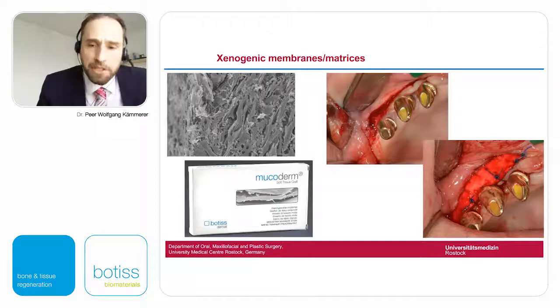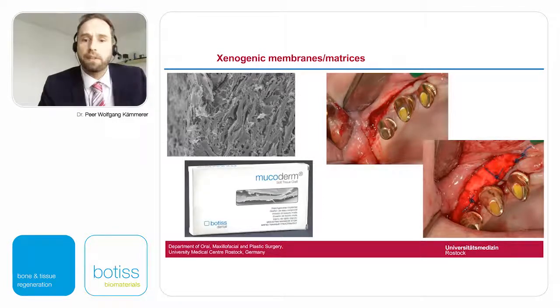Well, one of the major challenges after the vestibuloplasty, of course, is to reduce the post-operative discomfort, like scar contracture and subsequent, perhaps even loss in the sulcular depth. And as I told you, skin grafts have been most commonly used to cover the exposed periosteal surface, but we saw it, they have their own disadvantages.